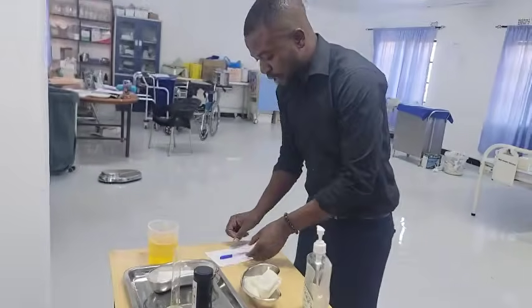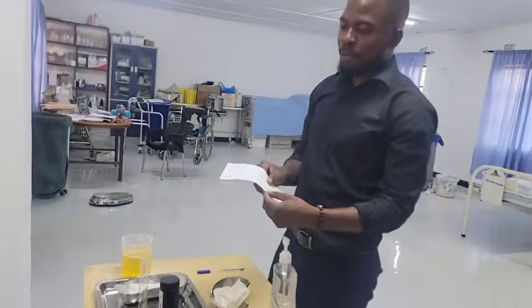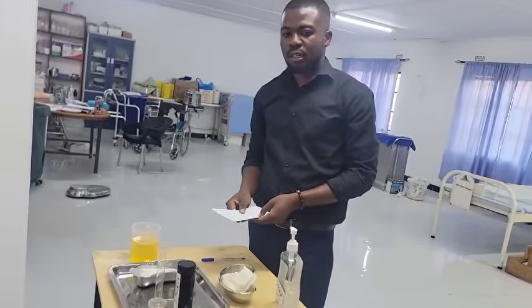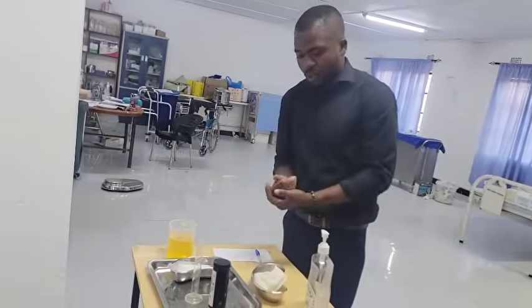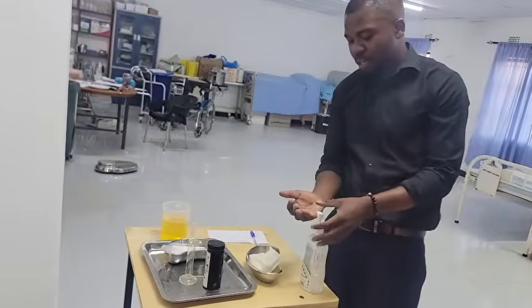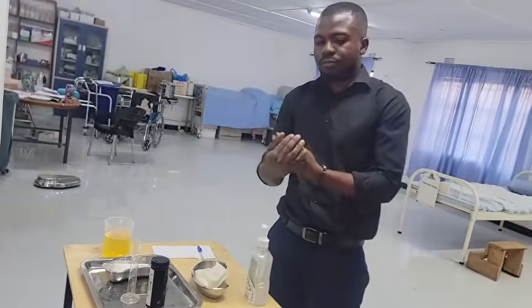So after you do this, you are going to show this one to the examiner, because the examiner has to see what you have done. Remember, what is not documented is not done. Yes. So the last thing you are going to do is, after giving this to the examiner, you're going to wash your hands and you dry them.